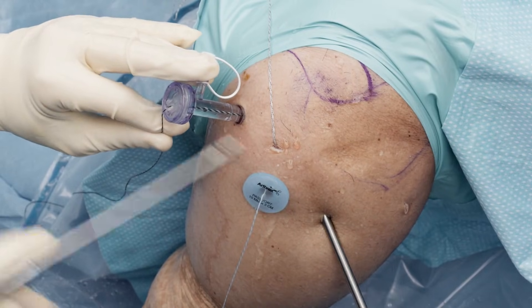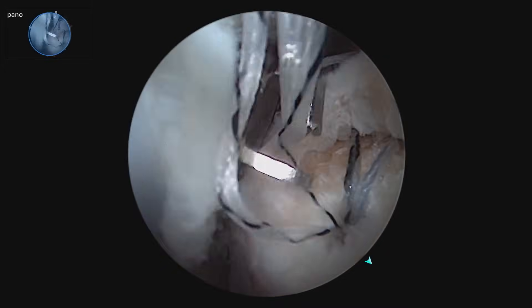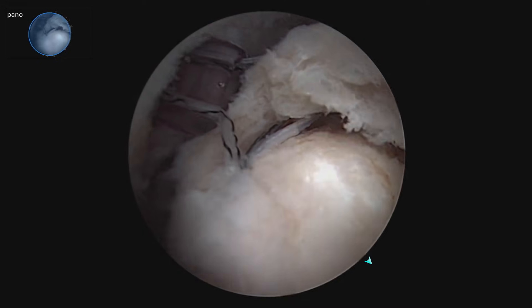And we're going to take everything out of our ASL portal for suture management purposes. There's our passes.